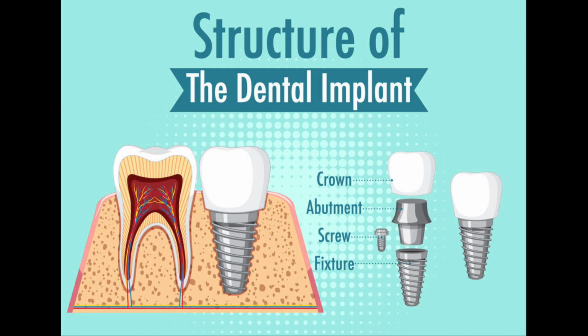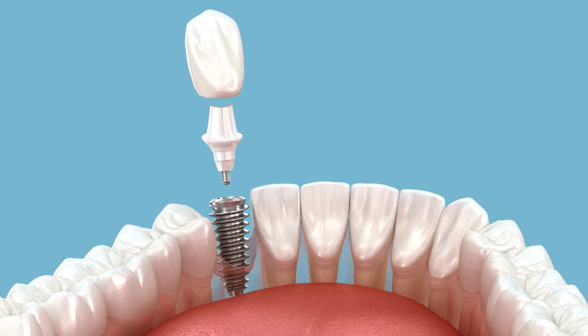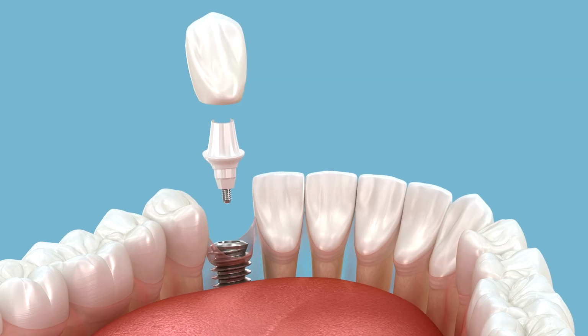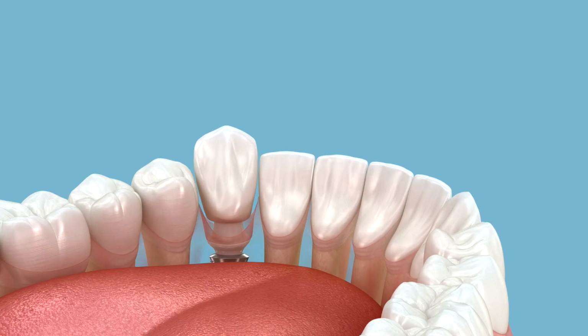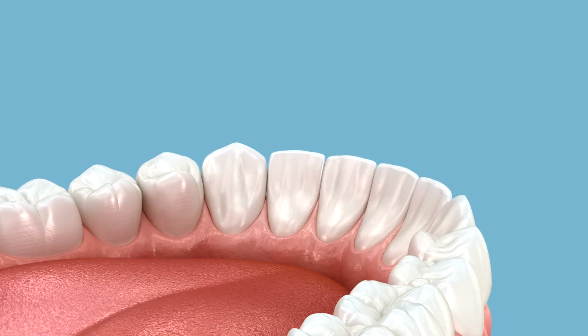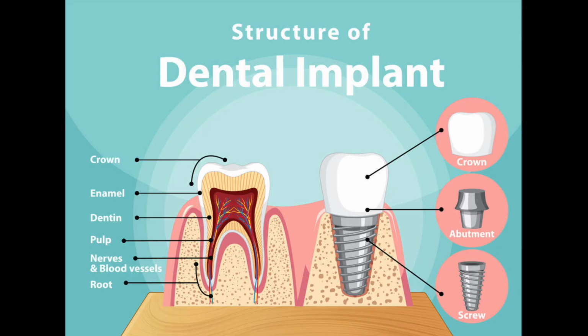Newer surfaces often incorporate hydrophilicity, affinity for water or blood, which theoretically attracts clotting factors and cells more rapidly, potentially accelerating healing time. Visual: show a drop of water spreading rapidly on a hydrophilic surface. The surface is the first point of contact between the mechanic and the biologic. It dictates the rate of healing.